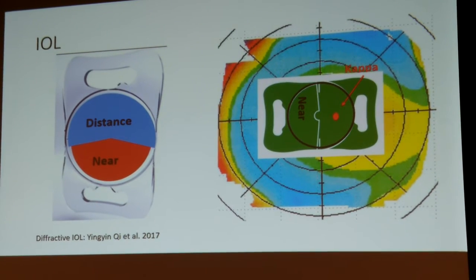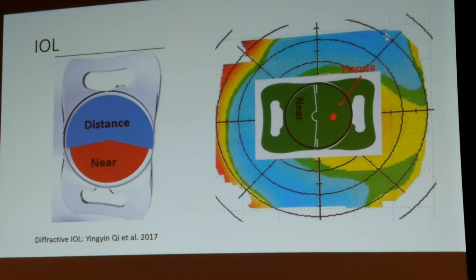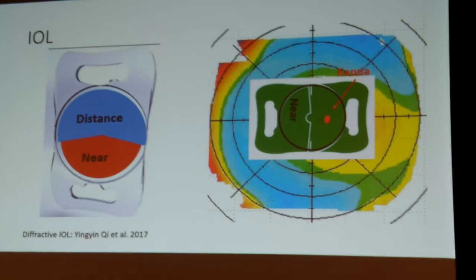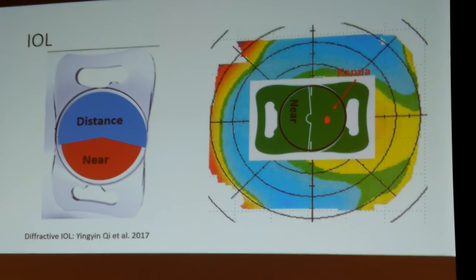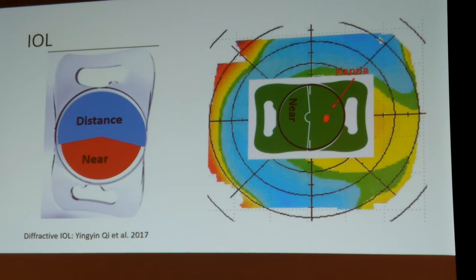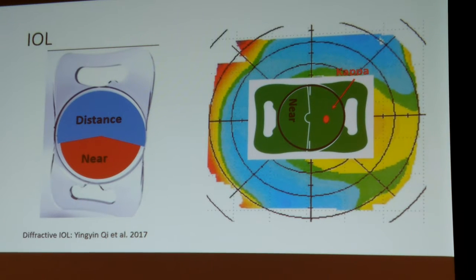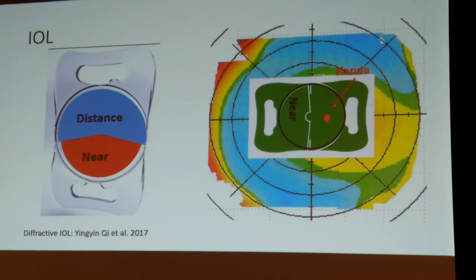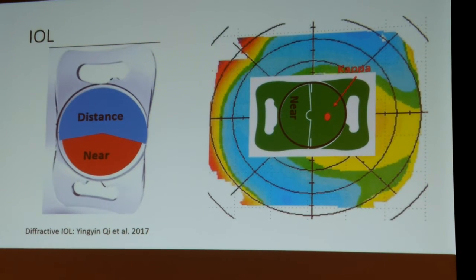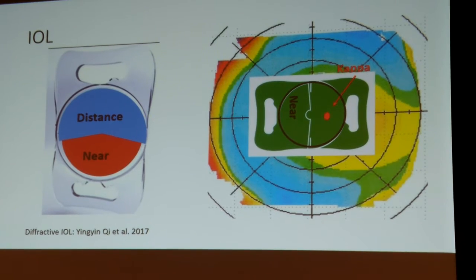In 2017, I think in the last Journal of Refractive and Cataract Surgery, they provided as well that if angle kappa is greater than 0.3 millimeters, you have more halos and glare with diffractive lenses. So it's probably then better to use a refractive lens. And we use those lenses up to an angle kappa of 0.5 millimeters. If angle kappa is greater than 0.5, we're probably a bit restricted, and we'll say, oh, probably could be difficult.